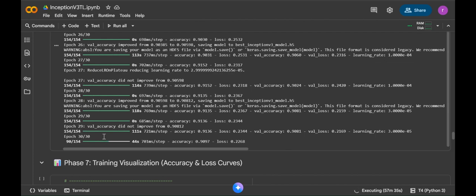Next, we used 2 transfer learning models, which are well known for their performance in image classification tasks, VGG19 and InceptionV3. Transfer learning allows us to use pre-trained models that have already learned image features from large datasets like ImageNet. This helps in improving accuracy and reducing training time.